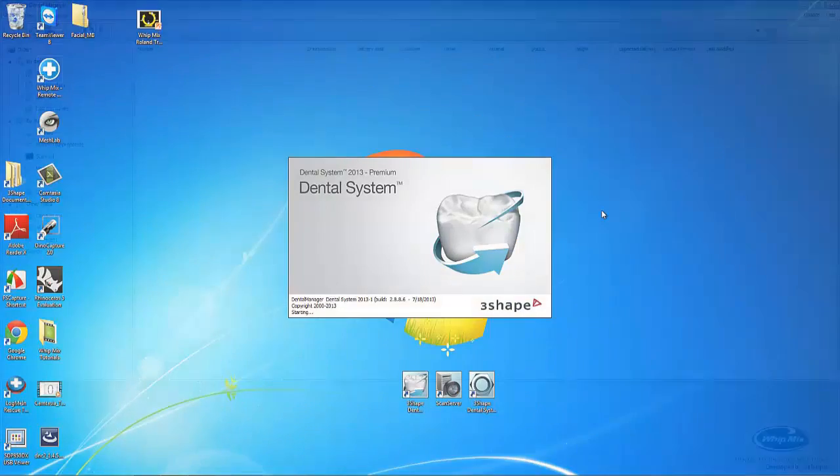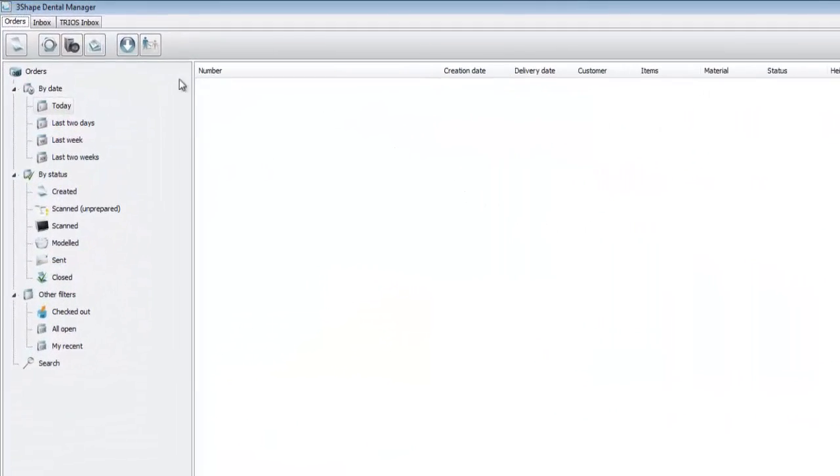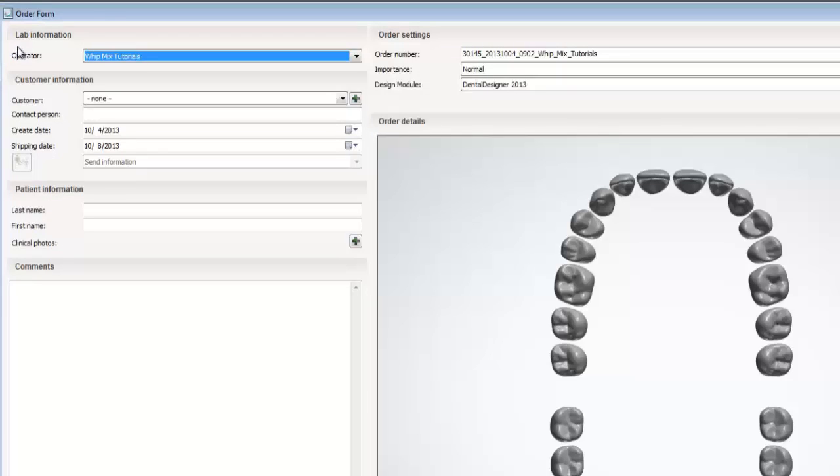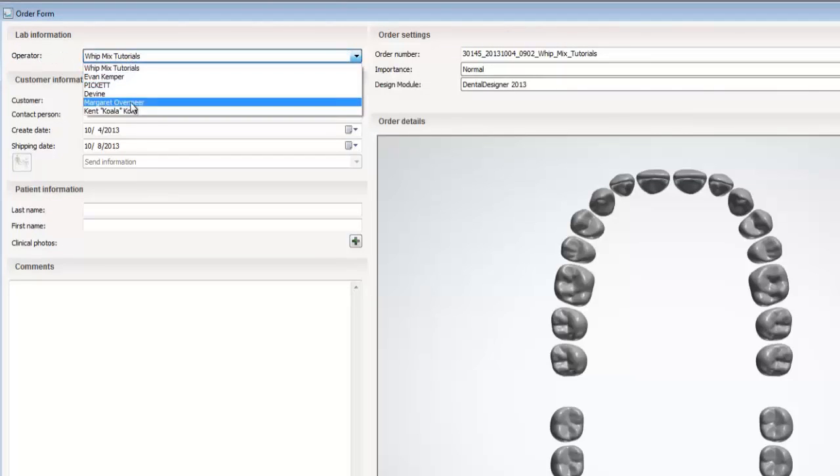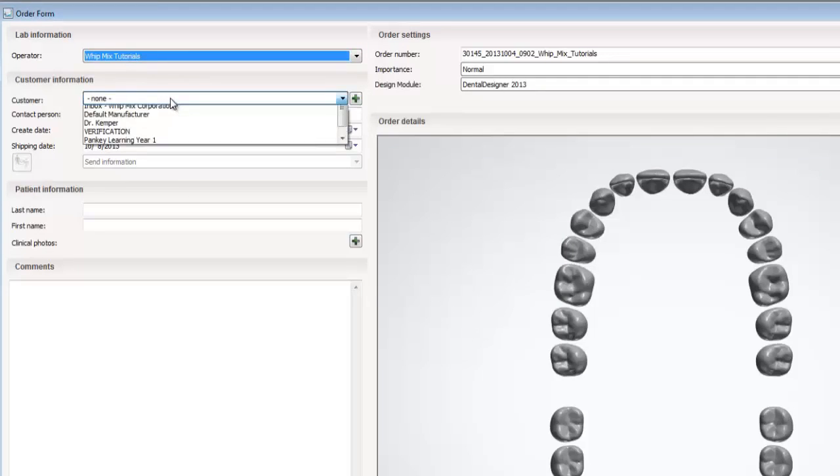Once the dental manager opens, we can click on the paper to create the new order. This will bring us back to the same form from earlier. Now as we can see, Witmix tutorials is the default operator.